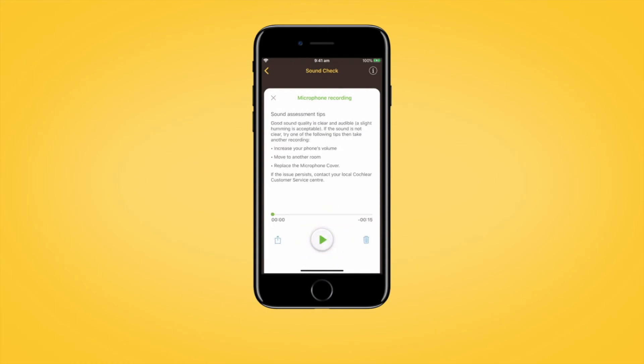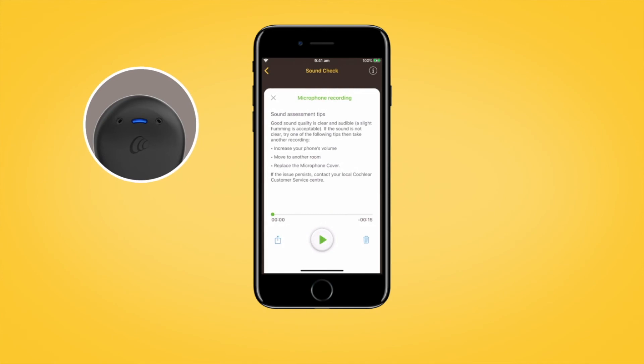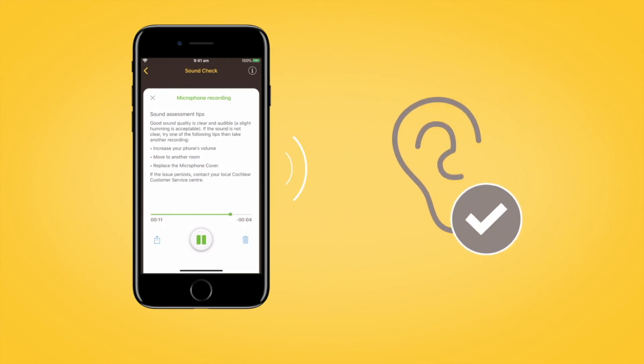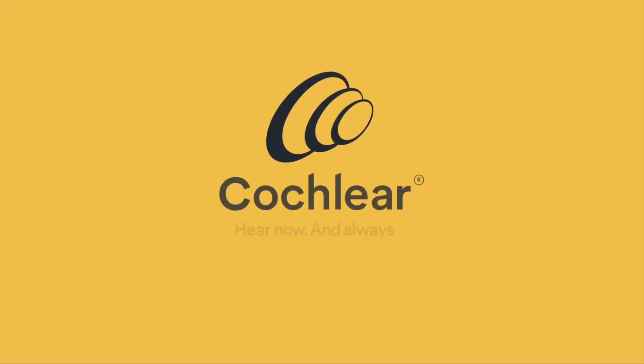The recipient will hear the Sound Processor beep at the end of the recording. Then tap the Play button to listen to your recording, and you will be able to assess the quality of the sound that the KANZO2 Sound Processor microphones are receiving.